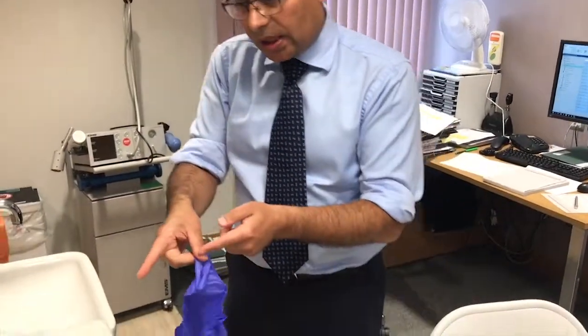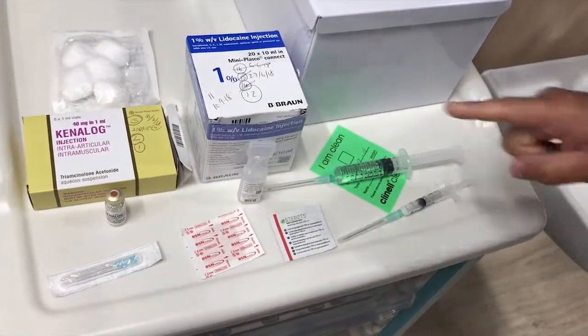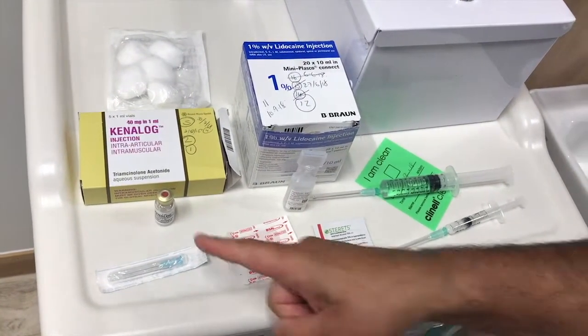I have here two syringes: one is a 10 ml syringe containing 1% lignocaine, and the second syringe is 2 ml containing 1 ml of kenalog.